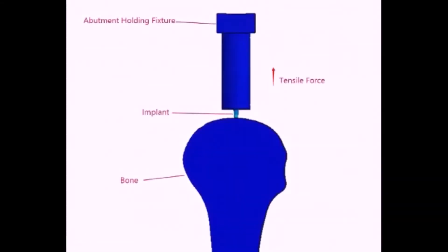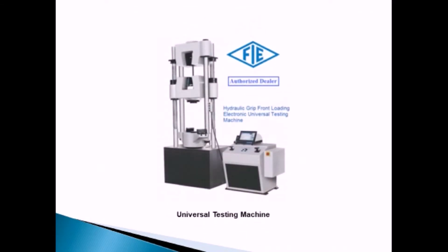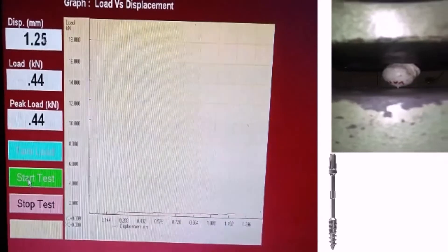The force is applied in opposite directions — the machine applies a tension force to pull the implant out of the bone, and the peak load is recorded on the software until failure of the bone or implant. The machine used is a Universal Testing Machine, FI Make UP60, with automatic force calculator software.